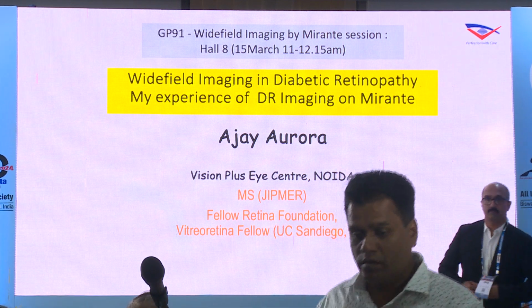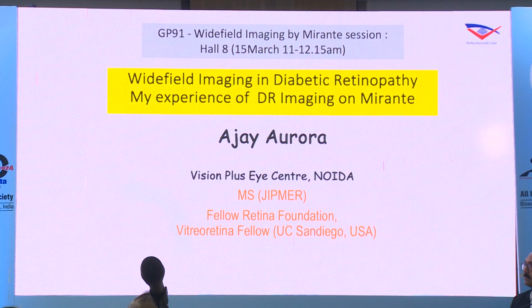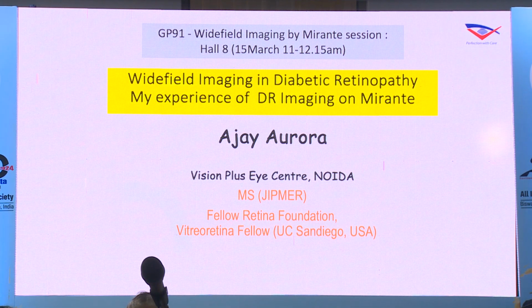Okay, so just to add on to what was just said about the limitations, I find only one limitation with Mirante, and that is when you are taking a disc photograph, especially for the glaucoma colleagues, because it is pseudo colors, you may not get the exact color. So when you compare disc to disc photographs, that's an issue.